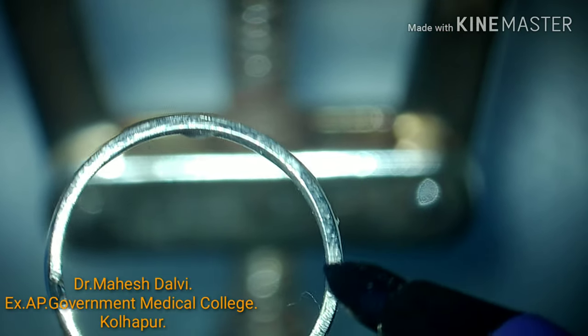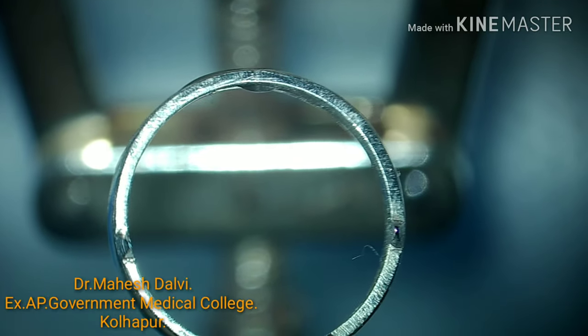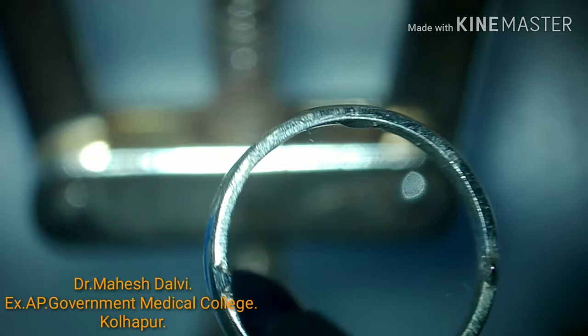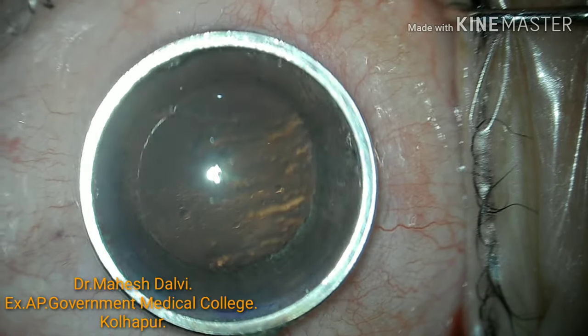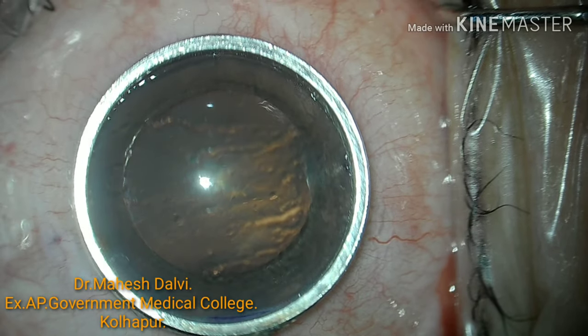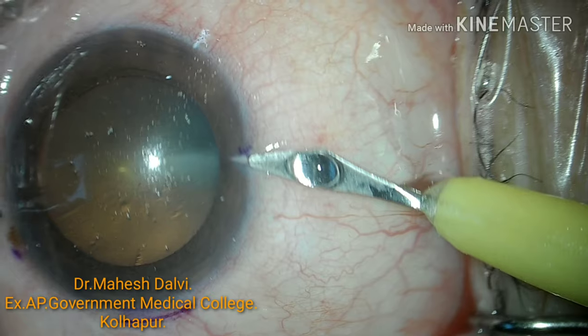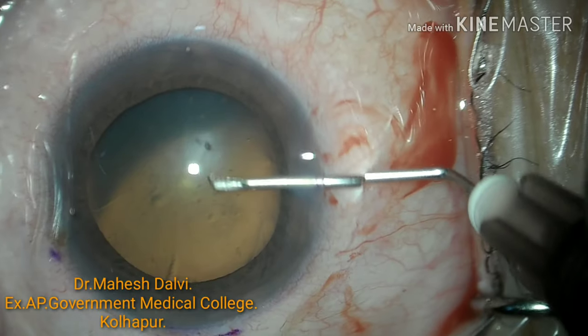This is the FECO incision marker. Here I am marking the side port incisions and main port incision with the help of a marker, the imprint of which will be marked on the cornea. We have to keep the cornea as dry as possible before making the markings.